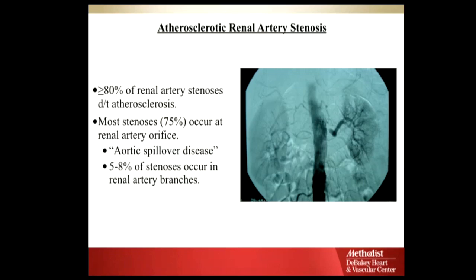And then usually if you're going to stent them, which is a better stent? I think tomorrow we'll talk about endo more than open. Balloon expandable, why is that? It's easier to place it where you want it, precisely. So it's a precise deployment, okay? Precise deployment, all right, what else? More radial force, that's very good.